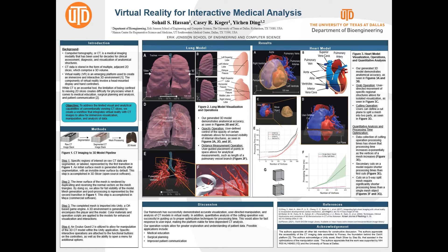A surface model representing the data is immediately generated after segmentation, and in our second step, we further process that model to fully render all surfaces, seen in the second transition in Figure 1. Our third step is importing that model into Unity, a game engine, to attach color materials and operation scripts to that model. Lastly, we use an Oculus Quest 2 VR headset and controllers to manipulate and interact with our model.